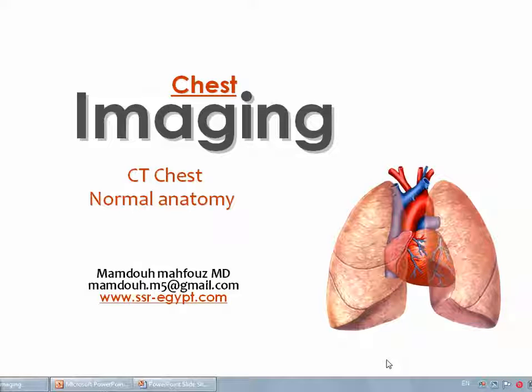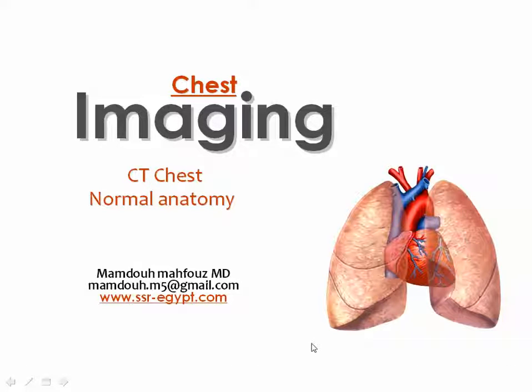Dear colleagues, we are now in the sector of chest imaging. We have finished one lecture which was about the way of how to interpret the chest X-rays. And now we are going to discuss how to look to the CT scan of the chest, not how to use the CT scan in the diagnosis. This is the purpose of most of the coming lectures, but this is just an introduction for the CT anatomy and the segmental distribution of the lung.